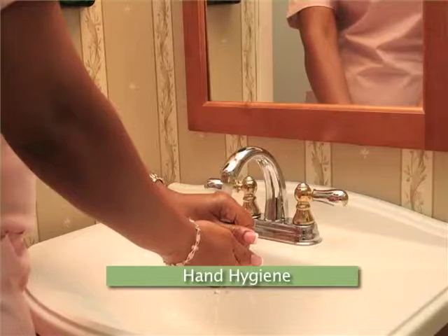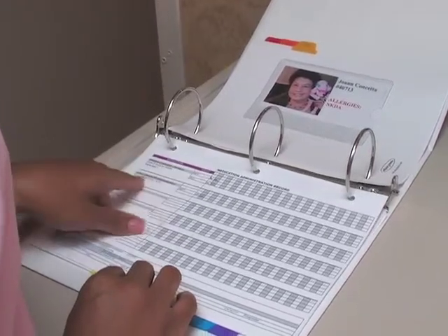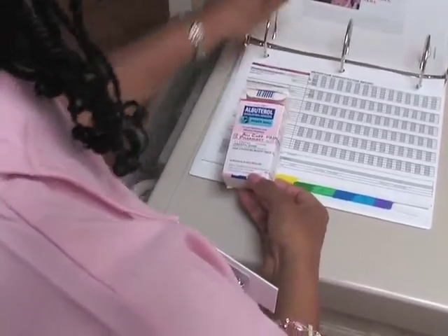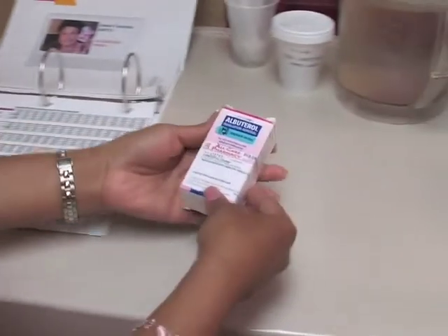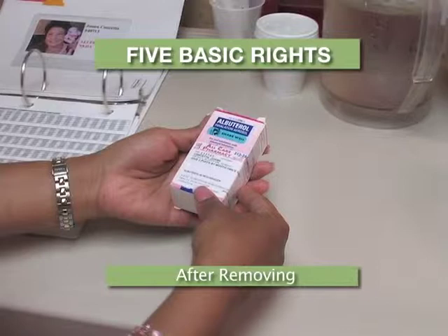After hand hygiene, the medication administration record, or MAR, is checked for the oral inhalant due at this time. Using the pharmacy label against the MAR, each of the 5 rights, right person, right time, right medication, right dose, and right route, are checked prior to removing the inhaler from the medication cart, after removing the inhaler from the medication cart, and prior to placing the inhaler on a barrier.